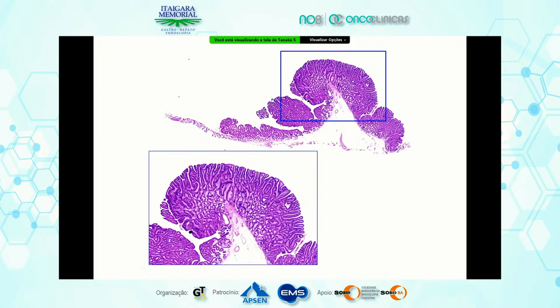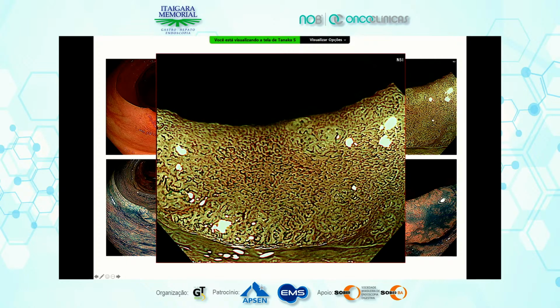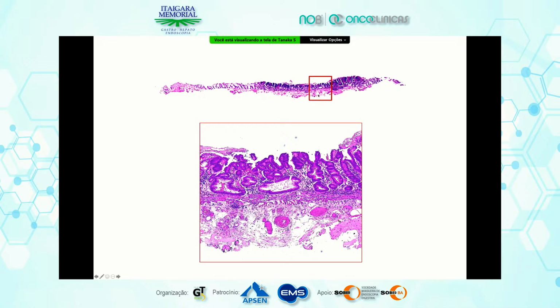This is a typical adenoma. Also, this is a flat region. How do you diagnose? Vessel pattern and surface pattern are both a little irregular. So we diagnose this pattern as JNET type 2B. This is an ESD specimen, intramucosal carcinoma.